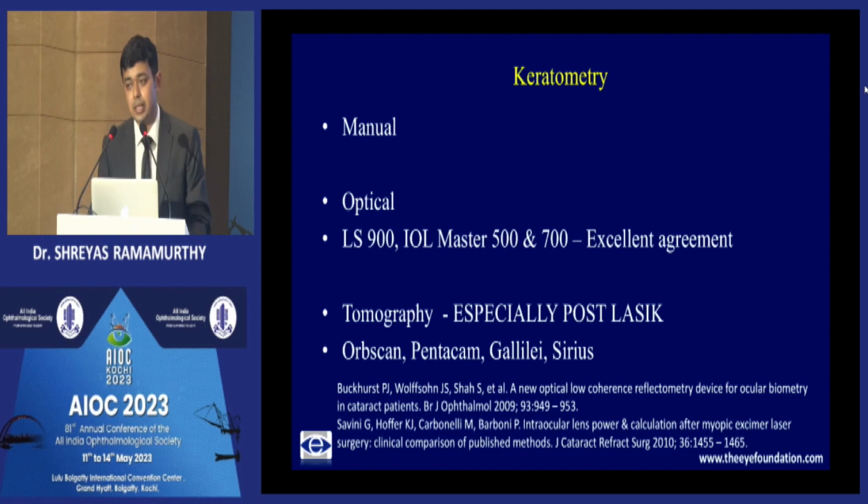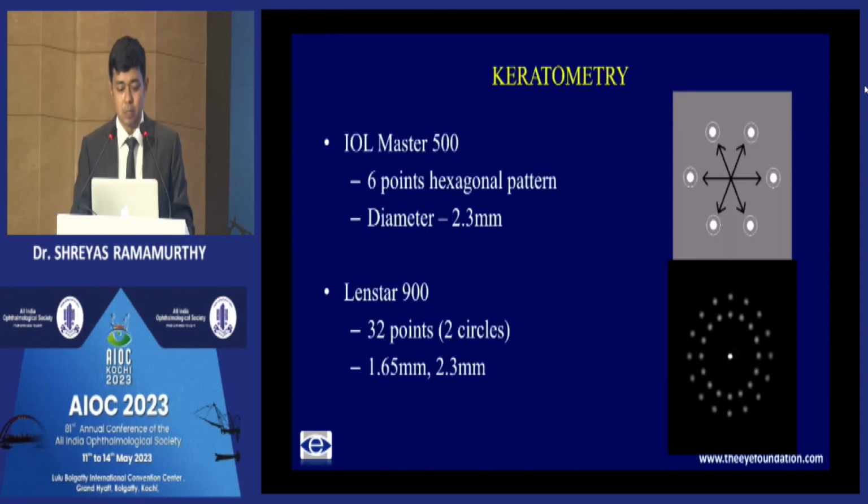So with keratometry, while manual still stands and can be used as a reference, more or less we have switched over to the optical biometers for accurate keratometry, and there is excellent agreement between all the devices. So whichever one you have, you can be happy using it. Tomography is also very useful, especially in post LASIK eyes. And irrespective of the tomographer you're using, Pentacam, Galileo, Sirius, all give excellent outputs. Pentacam has a specific EKR report as well, which can be used in post LASIK eyes. But coming back to the biometers in terms of keratometry, it's important that you know the number of points and the area which is being measured.